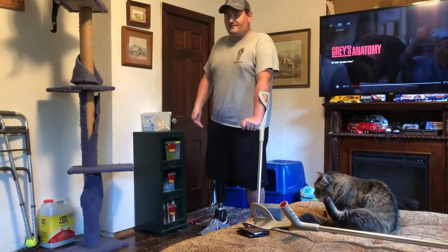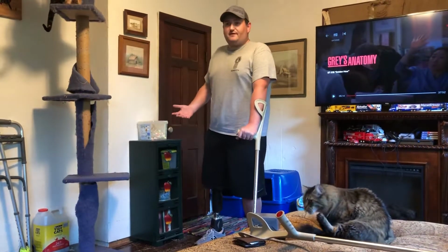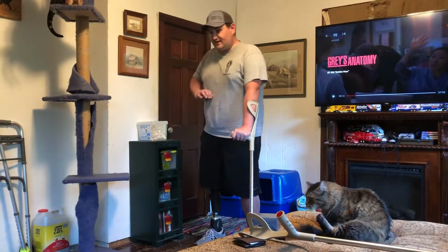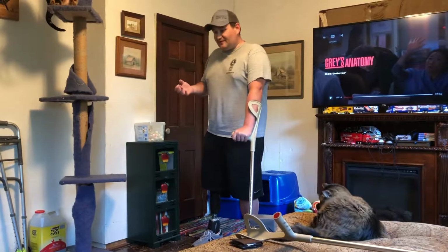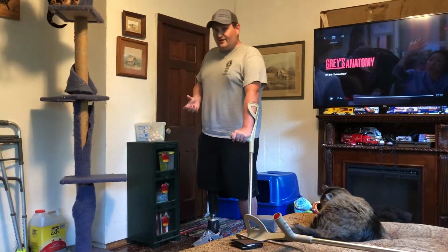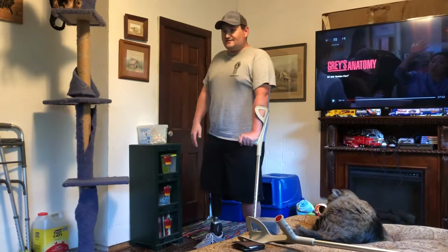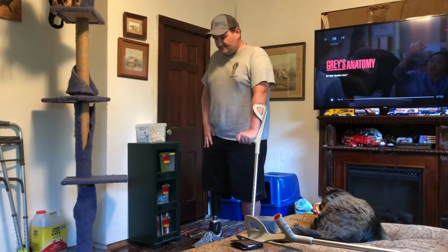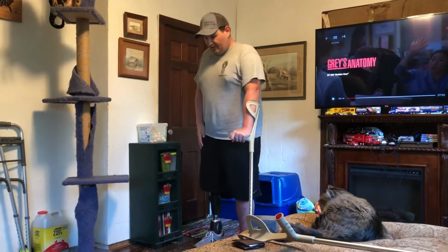Every time they make a change on this, it's like you're having to learn to walk again for the first couple of days. It changes all the characteristics of how things work. If they change your leg length by 1/4 of an inch, which you'll have to have it extended and shortened and all kinds of stuff as your stump fits your socket better and differently.